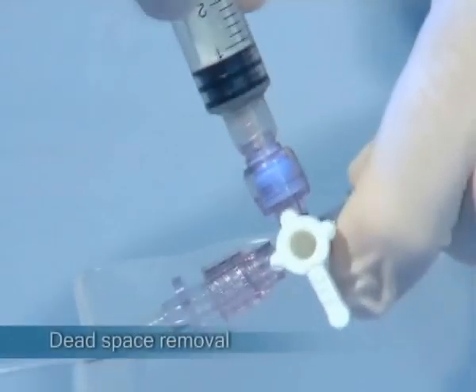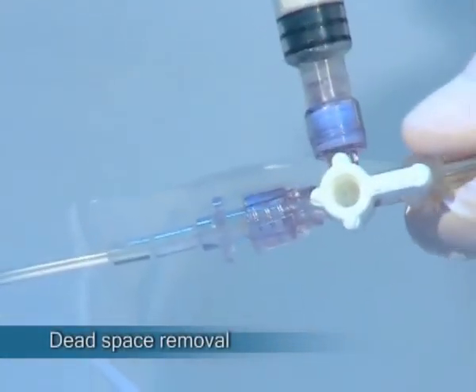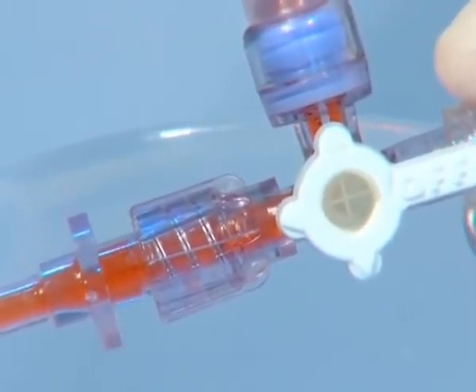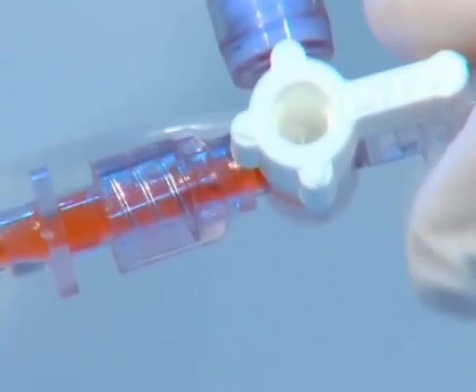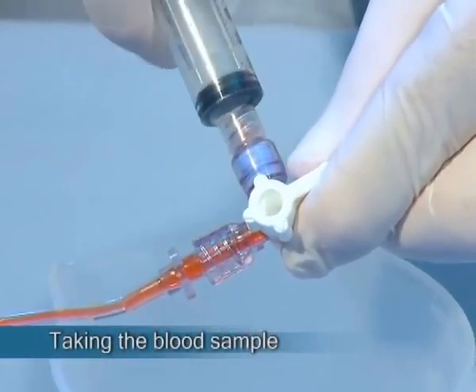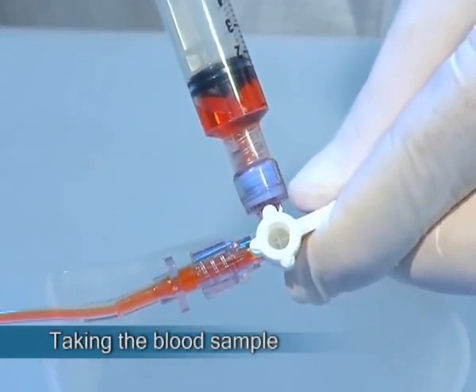Dead space removal is performed in the same manner as with other stopcocks with lure activated valves. To assure no blood spillage from the syringe, the Marvelous handle should be turned to the closed position prior to syringe withdrawal.